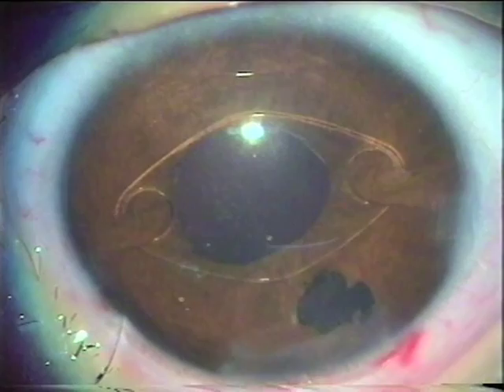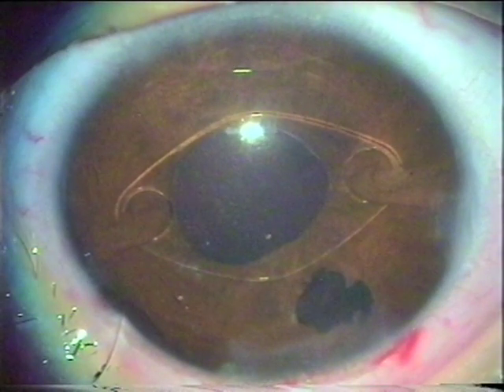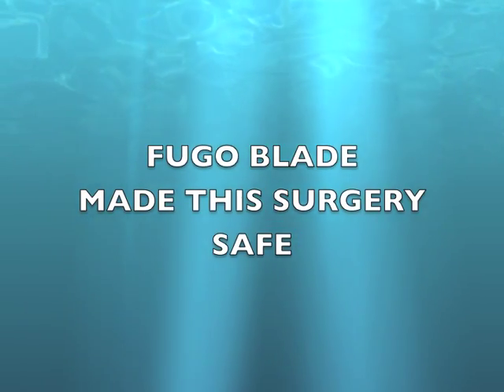The peripheral iridectomy. It was such a difficult case, and done with such simplicity and ease. The Fugo blade made this surgery safe.